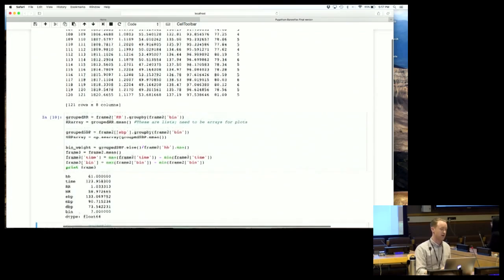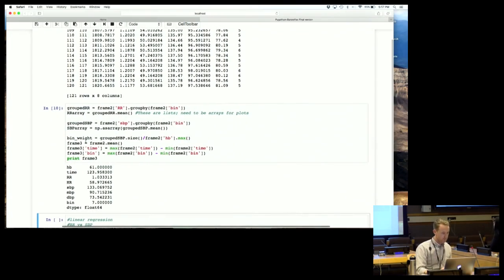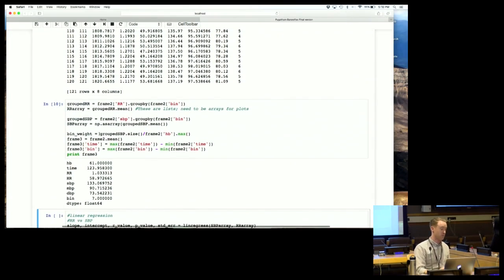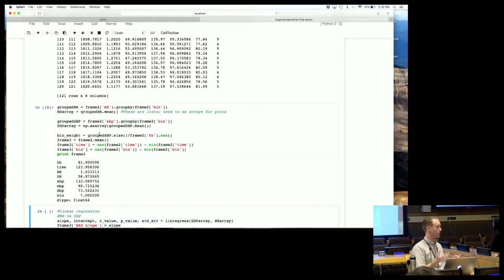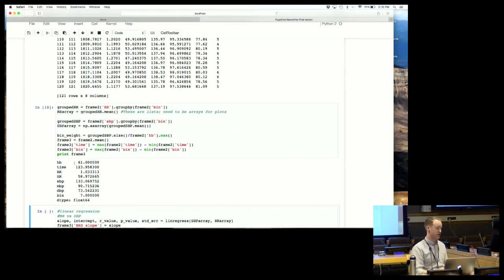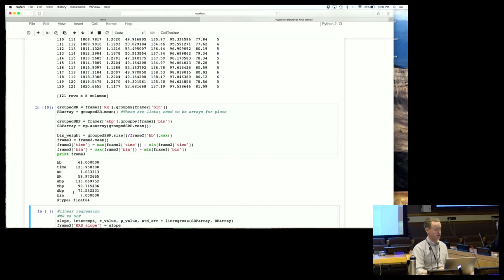I've got the bin values which we'll graph in just a moment. With pandas it's also really easy to quickly calculate summary statistics for all channels - I've calculated the average heartbeat duration, total recording length, average RR interval, average heart rate, average blood pressure values, and number of bins - seven bins total. From this we calculate a linear regression.